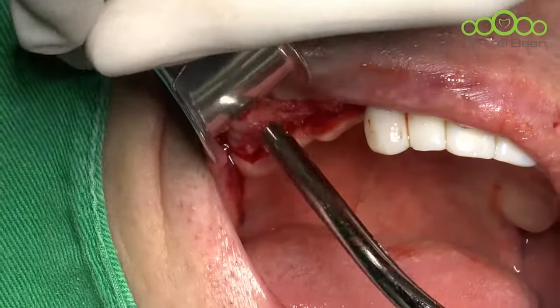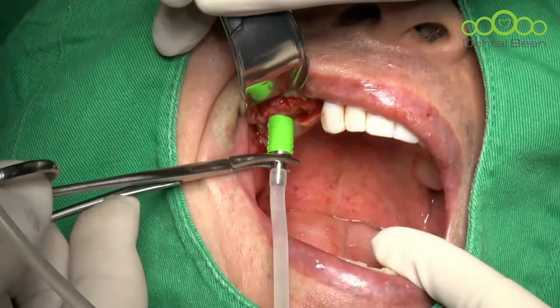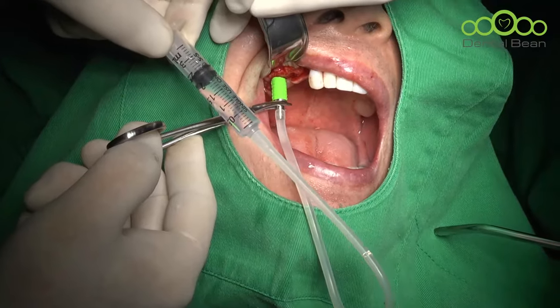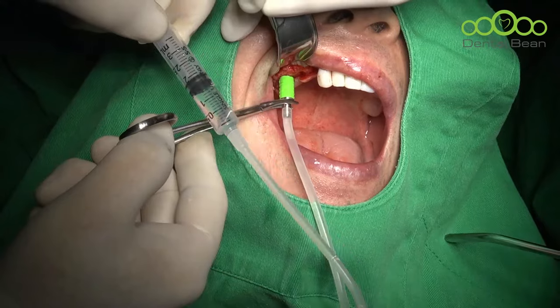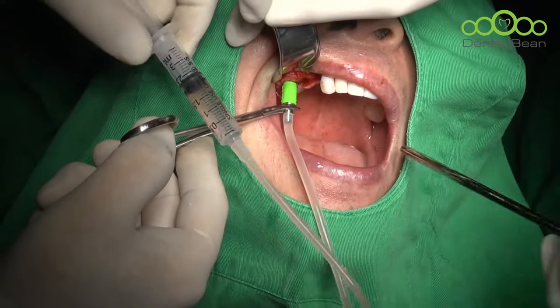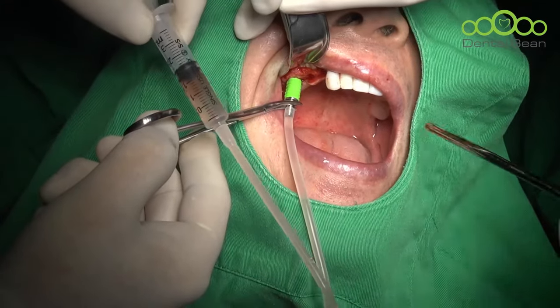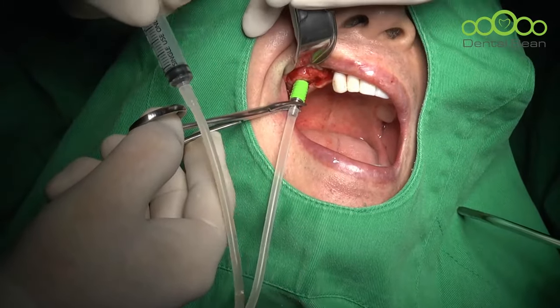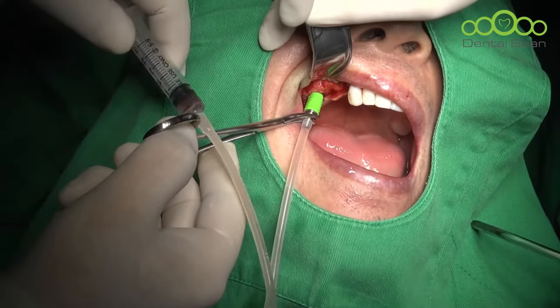Then I will separate the membrane with a hydraulic lifting system. Okay. Seal the hole tightly. Then zoom out, please. Okay. I will inject 0.5 cc and withdraw. Inject 1 cc, withdraw. You can see the color change. This means that the membrane is separating well. I'll spend the total saline. Okay, well done. I can feel a very smooth feeling when I inject the saline.